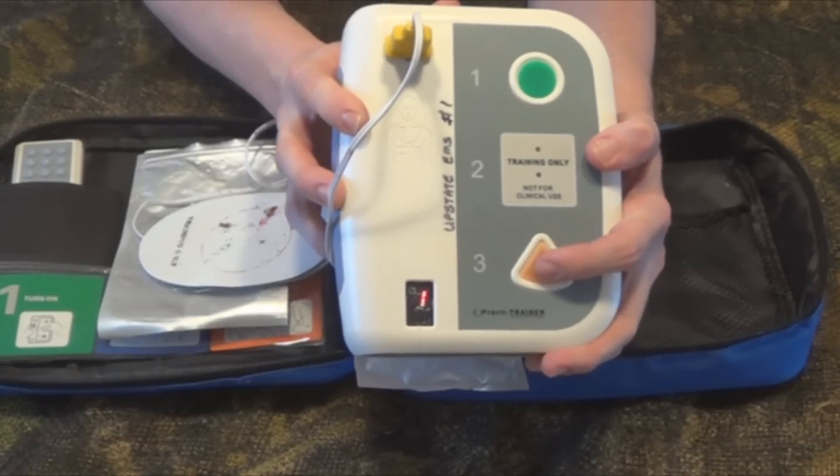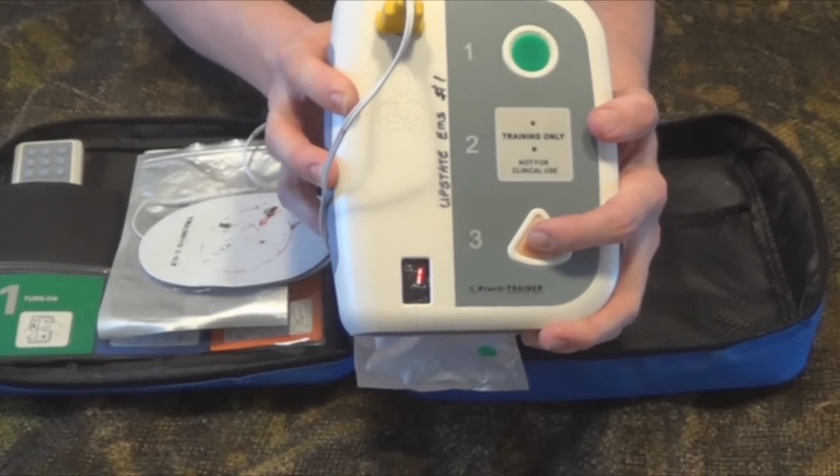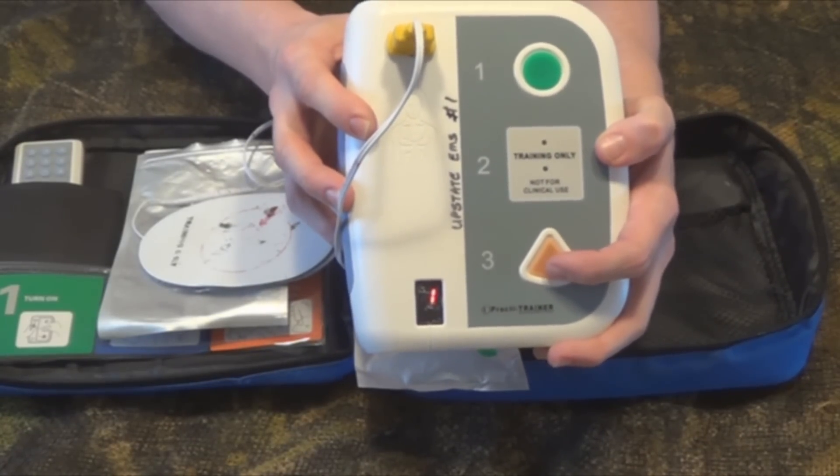Make sure no one is touching the victim. Look and confirm — don't just blindly push this button. Press the orange button. Shock delivered. Immediately start back CPR. Begin CPR.